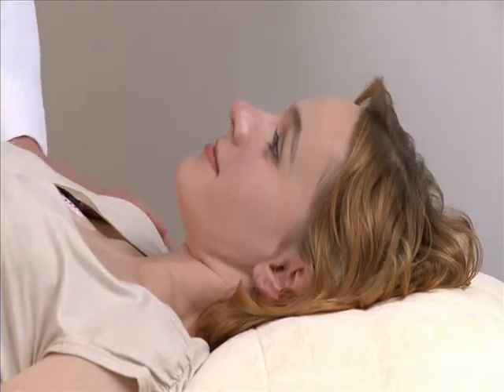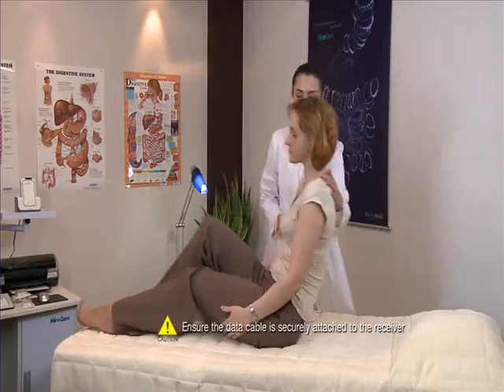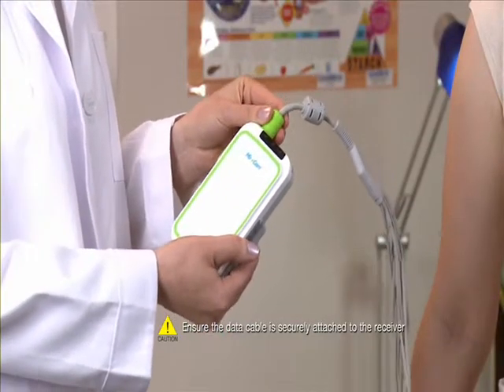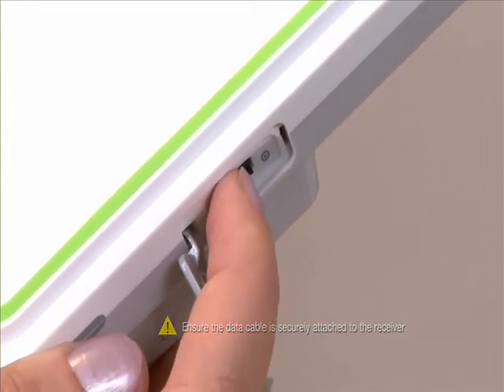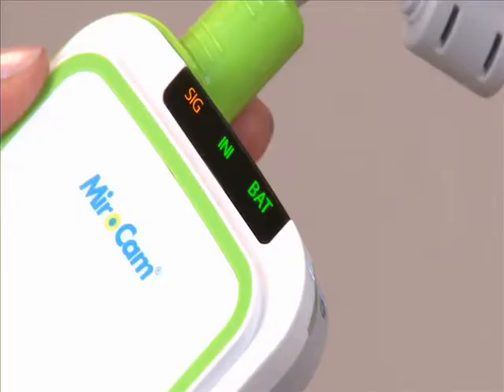After attaching the sensor pads, have the patient sit up and connect the data cable to the receiver. Turn on the receiver and check the battery indicator. The SIG icon should be orange, and the INI and BAT icons should be green. If the INI icon is orange, the receiver needs to be initialized. If the BAT icon is orange, the battery needs to be charged.